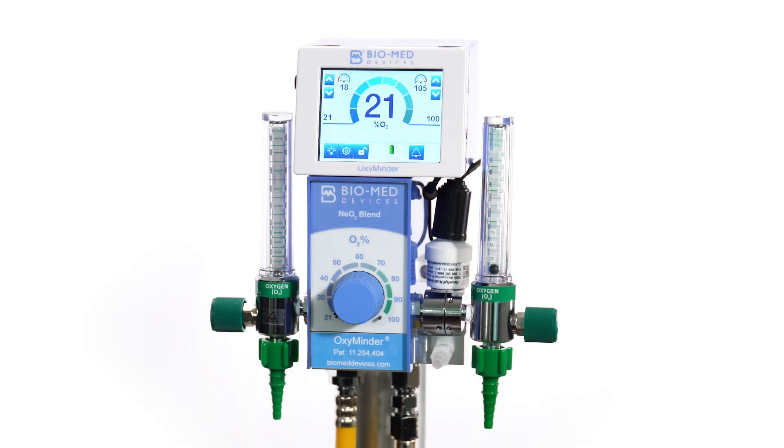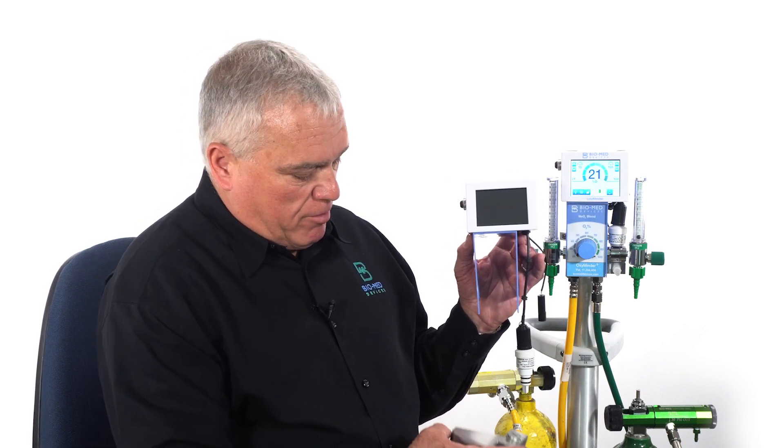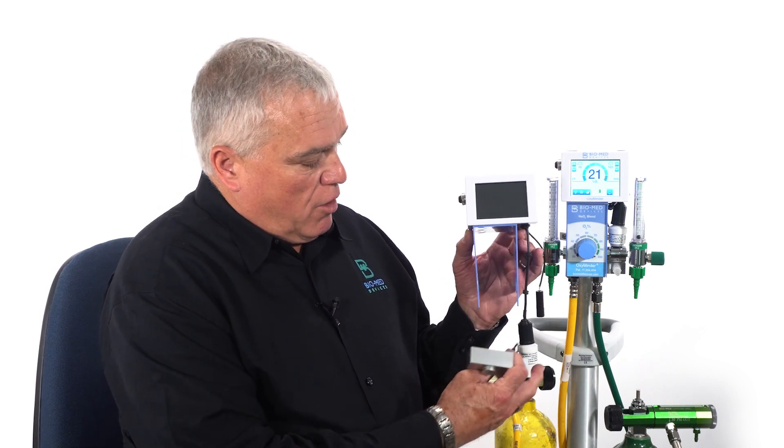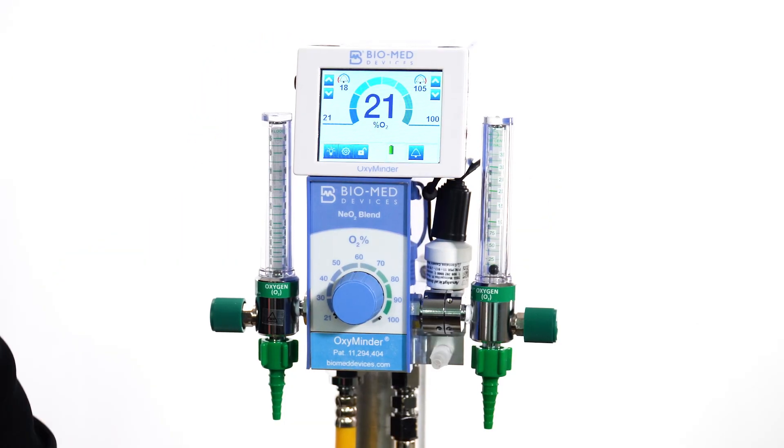The OxyMinder provides an upgrade to your existing Biomed Devices Blender or your Bird Blender. It works to fit right over the top of the blender, and it has this lower manifold that will work with those. It could also be added to your new blender purchase to provide an analyzer for that.